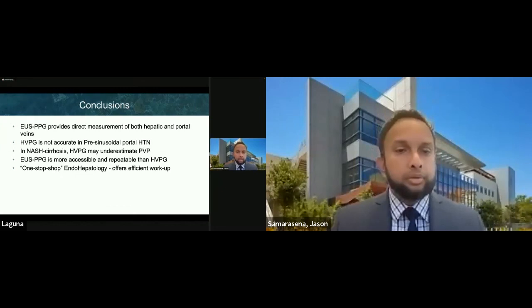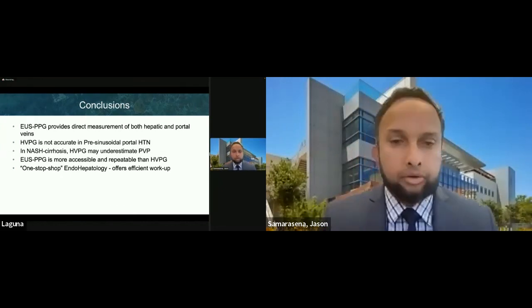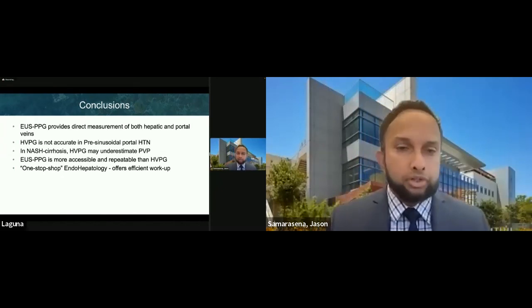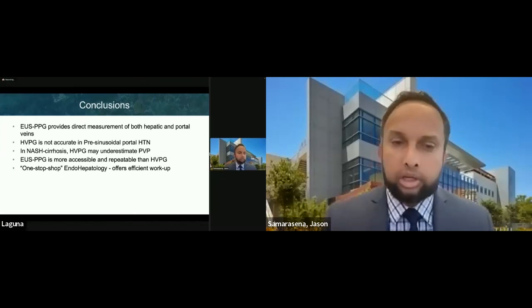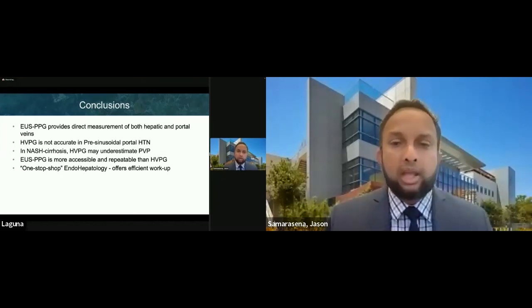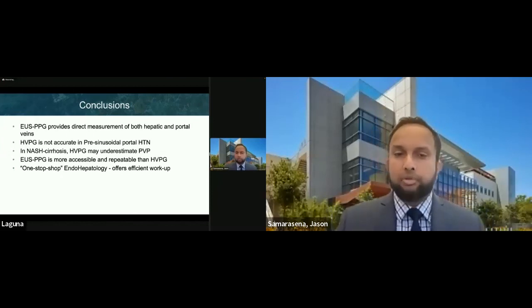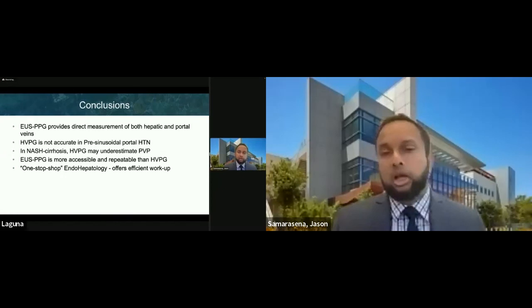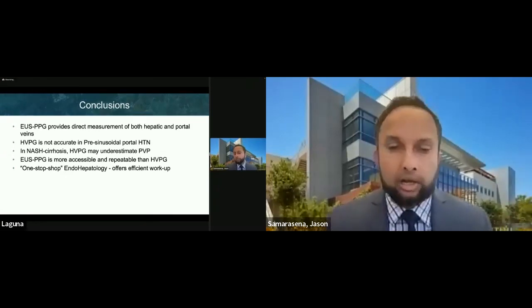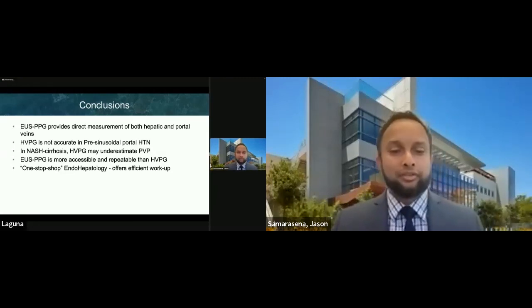And EUS-PPG is really becoming more accessible. So many endosonographers are picking this up. There's a commercially available device, and it's technically quite easy to learn for an experienced endosonographer. And so this one-stop shop option for endohepatology also offers an efficient workup for the patient, and potentially could have some cost savings as well. And with that, I'll conclude. Thanks very much.